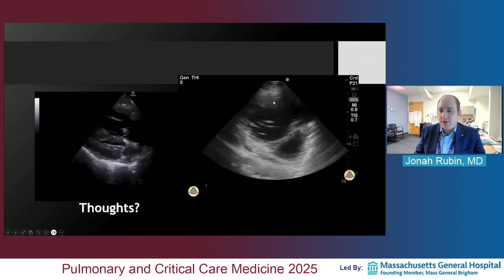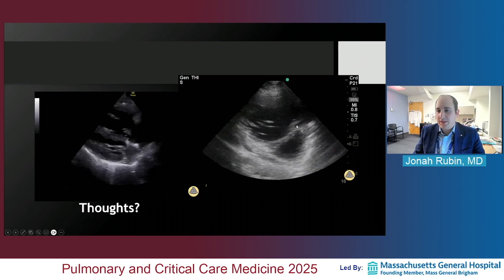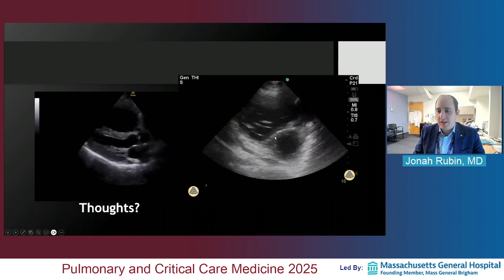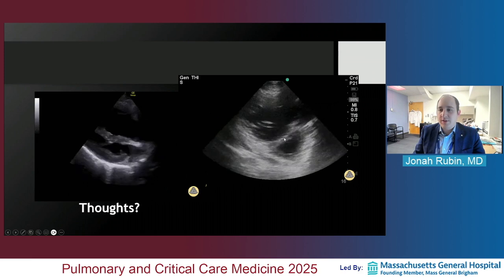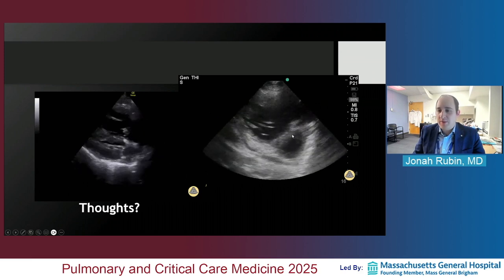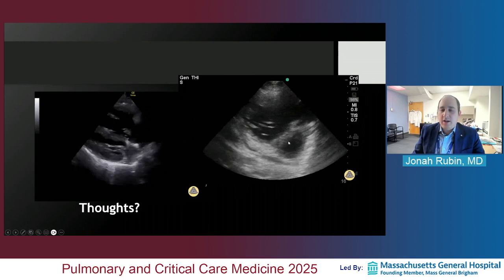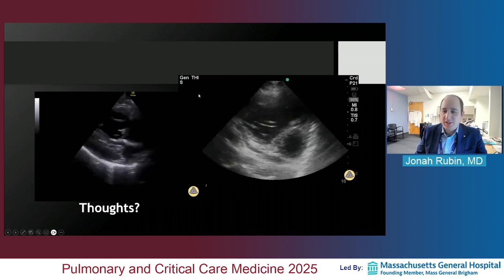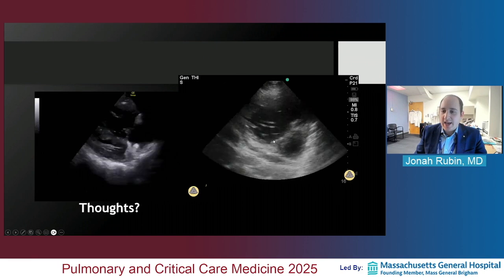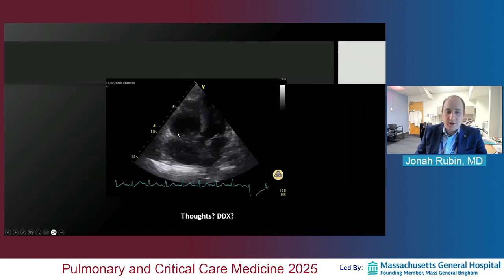And so here you go in the parasternal short axis view, again, maybe slightly below the papillary muscle level, and look how large that RV is relative to the LV. The LV looks like this tiny little donut relative to the RV, and you notice that septal flattening, which seems to be happening in both systole and diastole, which is something else to learn about in your moderate to advanced career pathway. But noticing a D sign at all is a sign of the RV impinging on the LV and maybe RV dysfunction.